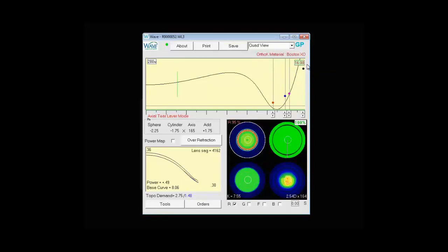Anything over an 11-5 diameter, so 11-6 and above, is a large diameter lens. And it will change the diameter selector to a green color just to let you know that you're in a large diameter lens.